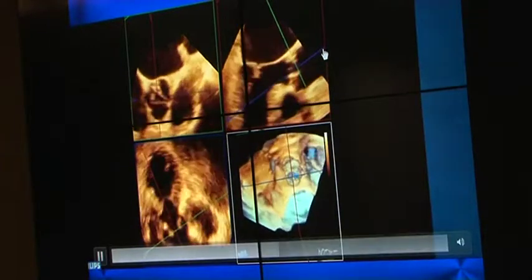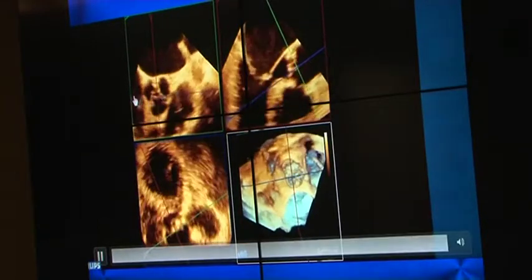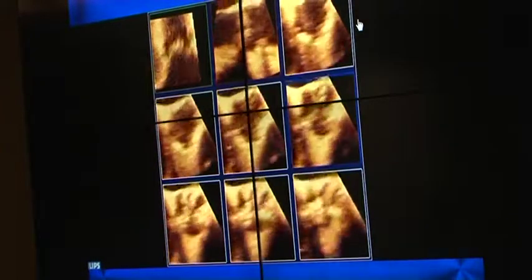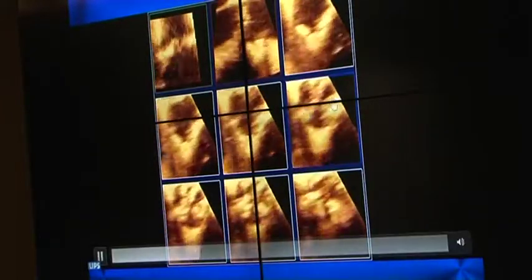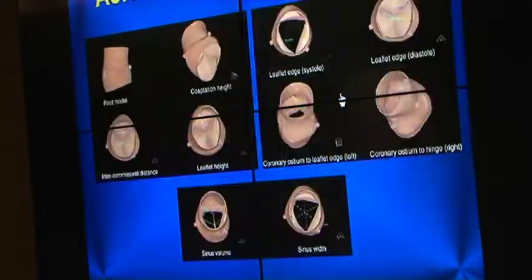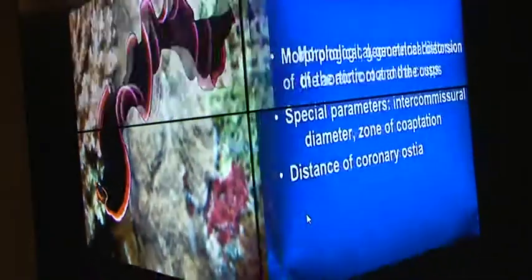According to my orientation, I always align the blue cut plane in the long axis of the LVOT and ascending aorta, and then with I-slice, we can define the narrowest portion of the orifice. Some vendors provide aortic valve models. We don't have it with Philips, but this is, for example, a Siemens model, which is quite accurate and tells us also about the dynamicity of the aortic root.